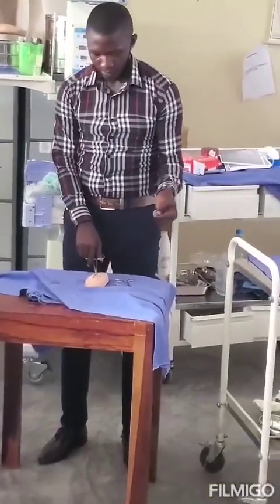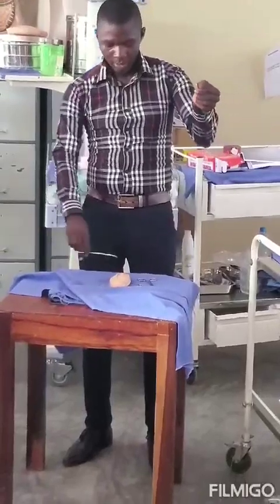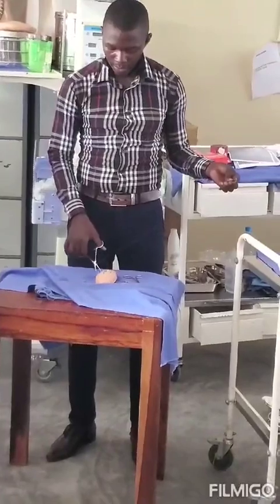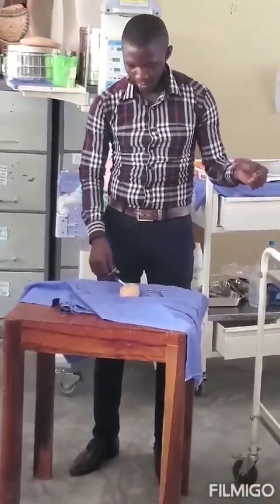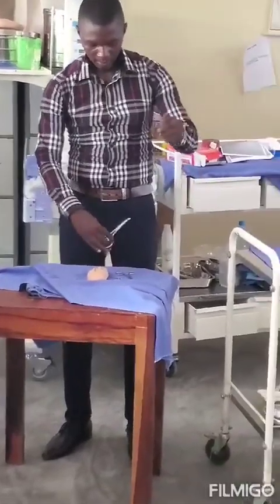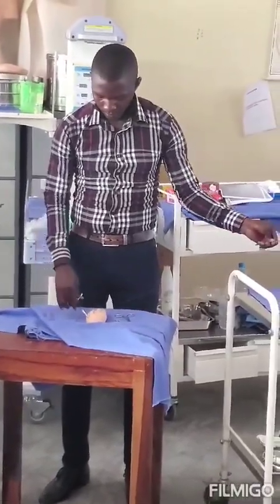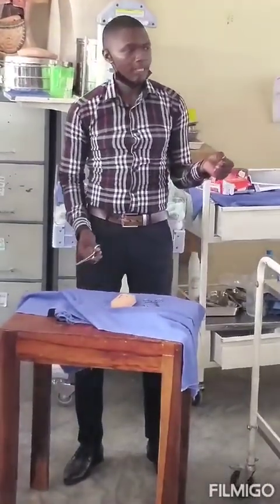Once you remain with just a small string, you will go in behind like that twice. Then you pull this one. Then you stretch like that. Then you do it twice like this. So once you do it twice, then the knot is now tight.